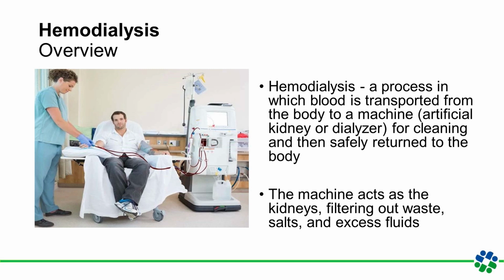Blood is carefully drawn from the body and channeled into the dialyzer, but instead of thinking about the dialyzer as a simple laundry service, it's more accurate to imagine it as a high-tech filtration system, one that is finely tuned to mimic the natural functions of healthy kidneys. The dialyzer has a series of semi-permeable membranes, much like the microscopic filtration units in your own kidney.